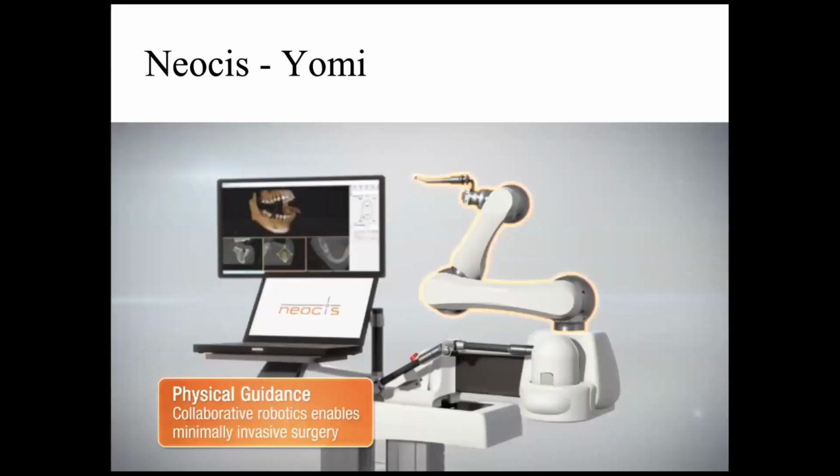Then the other thing is the physical guidance: once you determine the path, the angulation, and the depth that the implant has to go, you cannot actually change that. The robot itself, believe it or not, is 400 pounds. You can't just pick this up. This thing is super strong. If you put your whole weight on it, you cannot make that arm move.